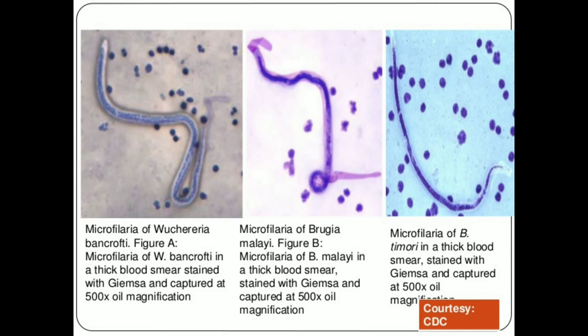The first image shows microfilaria of Wuchereria bancrofti in a thick blood smear stained with Giemsa stain, captured at 500x oil magnification. The second figure shows microfilaria of Brugia malayi in a thick blood smear stained with Giemsa stain, also at 500x oil magnification. The third picture is microfilaria of Brugia timori, also in a thick blood smear stained with Giemsa stain.